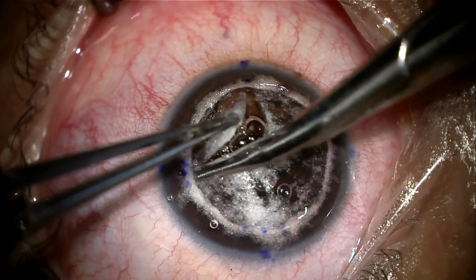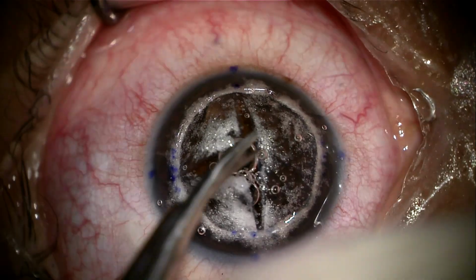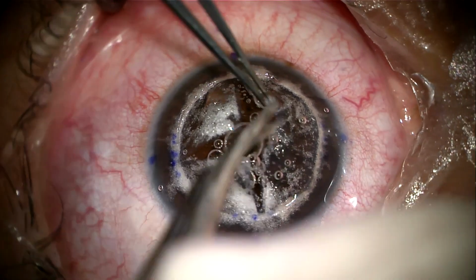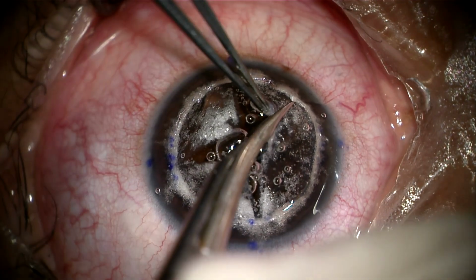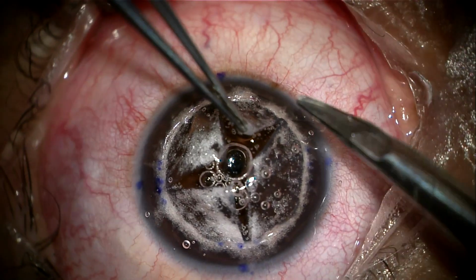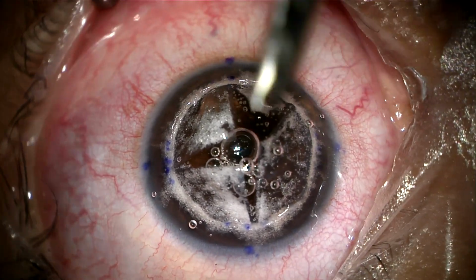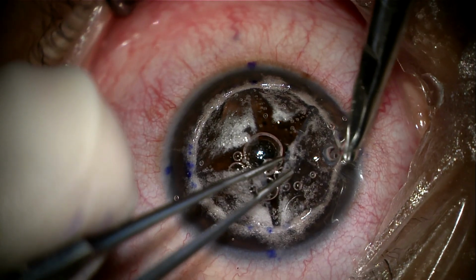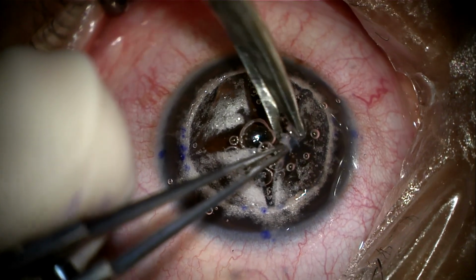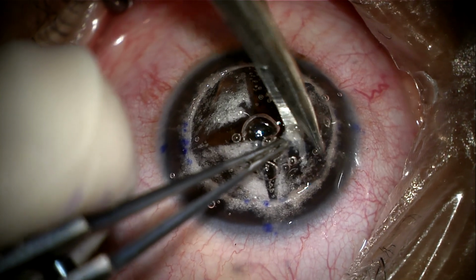The stroma is then divided into 4 or 5 quadrants according to the surgeon's preference and the availability of right and left-handed scissors. Scissors should be introduced carefully and avoid entangling the predescemetic layer and Descemet membrane in the tip of the lower blade. Cutting should be in snips, with reintroducing the scissors after each cut.